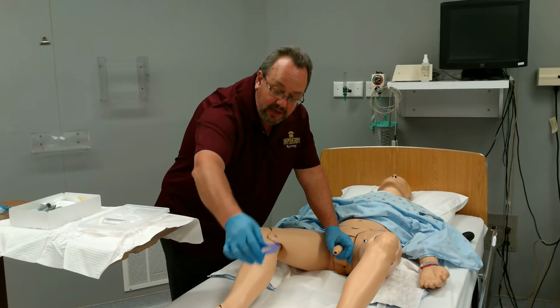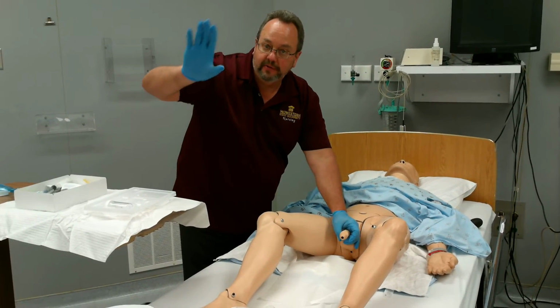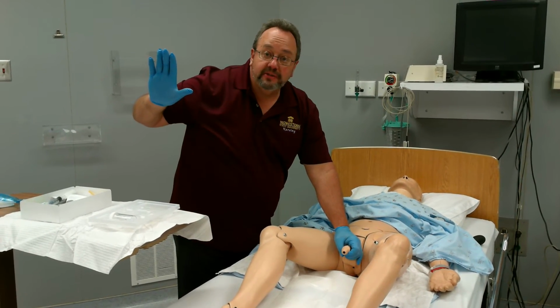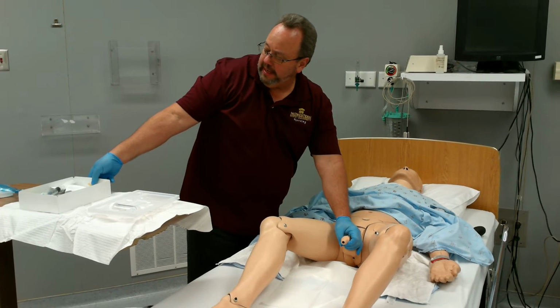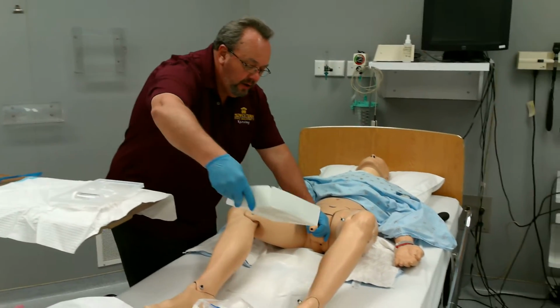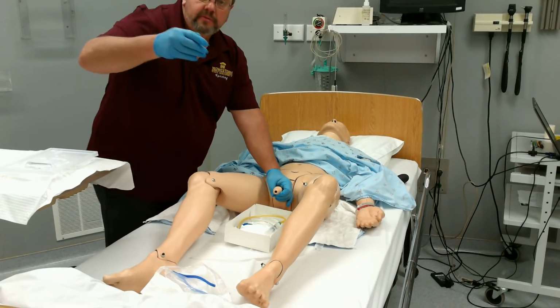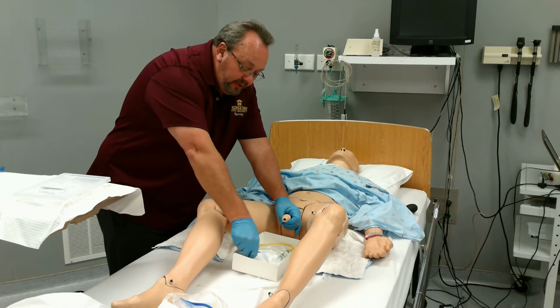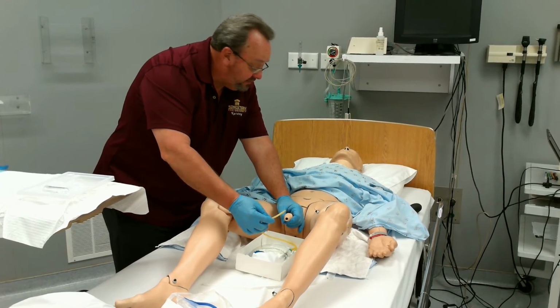Now with the last one done, I don't need those anymore, so I will put those right there. Just dropping everything because I must keep this hand sterile, ready to insert my catheter. So I will grab my box with my sterile hand, lift it from the end so that I can swing it around without touching my patient, and put it right here on that drape.